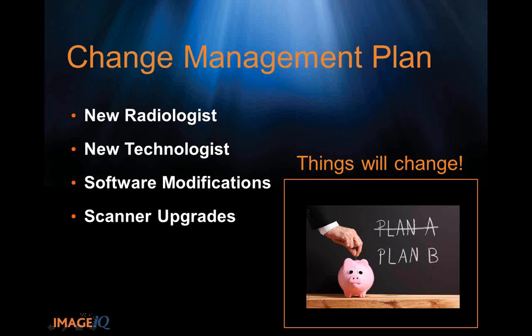And I know we've mentioned the 25-year trial a bunch of times, but over 25 years, you're getting new scanners. I sure hope so. Yeah, I would hope so. Right, and that's a great point, because there may be totally new scanners. Maybe it's a new modality within the 25-year period. Do you embrace that, or do you stick to what you've got? That's a very good point.